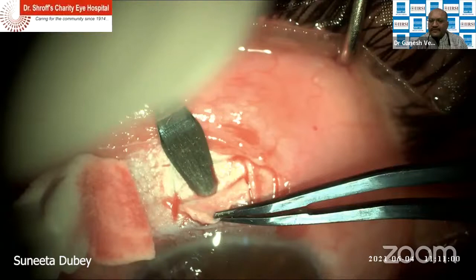I would just go back and tell you the recent European Glaucoma Society guidelines. They say cost containment is a component of glaucoma care. So whatever you use, you should be very, very conscious about it. And I would always say make it as simple as possible so that you can train the next generation. Both work well, actually. It is equally smooth whether you use a 15 number blade or a crescent. It's just a matter of how steady you are as a surgeon.